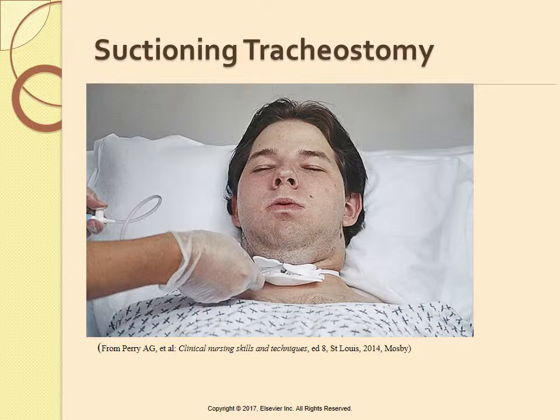You can do one of those 3 things. The method chosen will depend on the patient's underlying disease and acuity of illness. The patient who has had a tracheostomy for an extended period of time and is not acutely ill may be able to tolerate suctioning without use of an MRB or the ventilator.